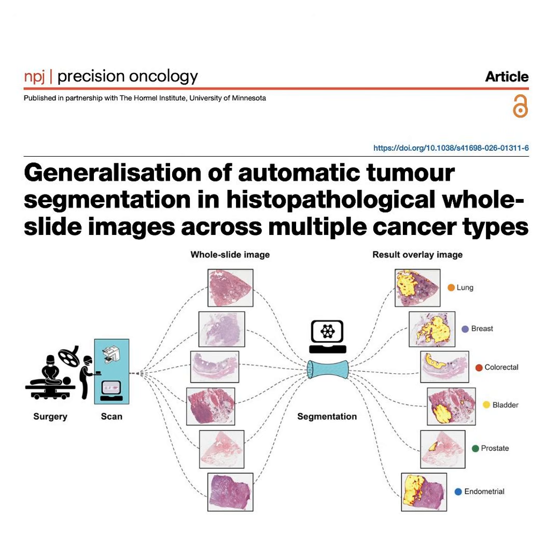Okay, before we dive into how they validated this, let's do our second mini recap. Let's map out the pipeline we just discussed. Go for it. Bullet 1. We take a massive digital slide, downsample it slightly, and chop it into overlapping 7,000 pixel tiles. Bullet 2. We run those tiles through a batch norm-free NFNet encoder and a DeepLab spatial decoder utilizing 7.3 million parameters. And bullet 3. We stitch the tiles back together, blend the edges into a heat map, and finally snap that heat map to a stark binary mask using that dual threshold hysteresis. That is the complete architecture, beautifully summarized.